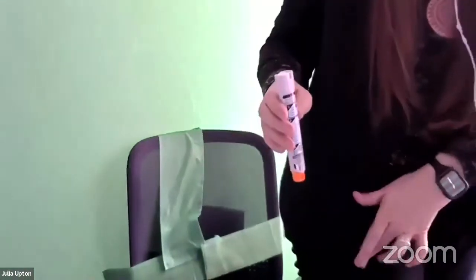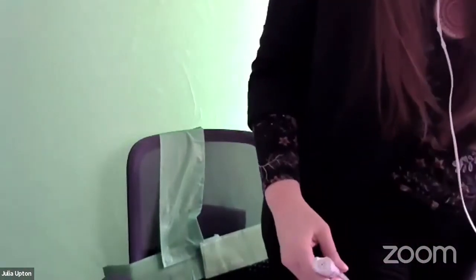So on the EpiPen, you're taking the back off. The back is blue, so blue to the sky, orange to the thigh is what we often say. You're taking the back off. We want to take it off straight so that we don't turn it sideways or break this pin. You just want to pull it straight off the back. And then it's the upper outer part of the thigh that we would just push the orange end into.